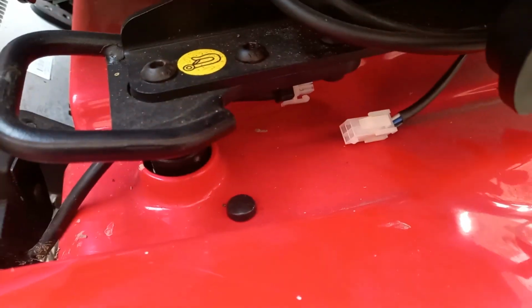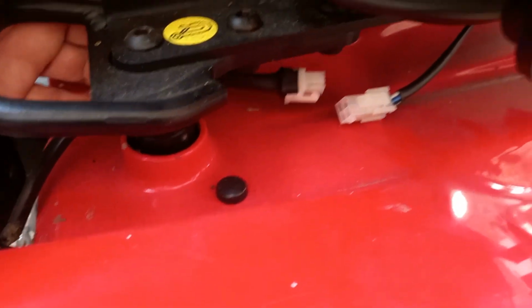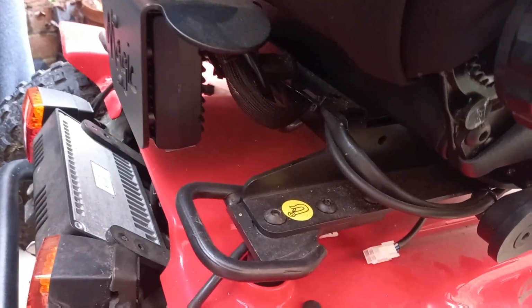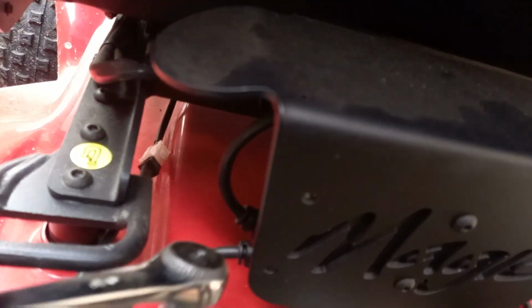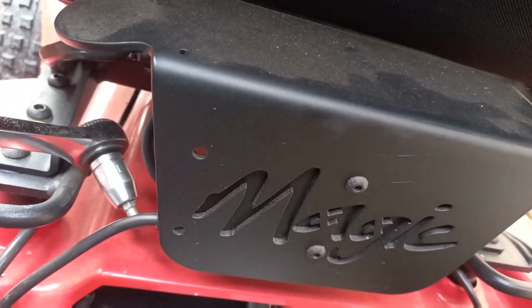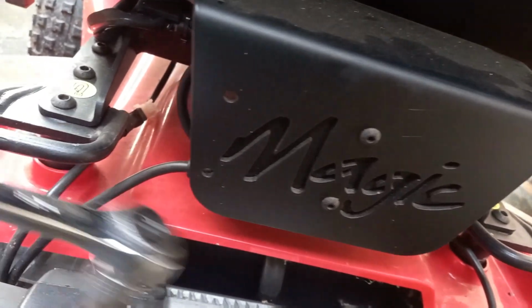Yeah. Right, this has got indicators on, so we've got indicators and lights. Yeah, I've just disconnected that connector. The seat's got to be lifted off, because the batteries are underneath the plastics. You've got to disconnect anything that's connecting the seat to the other parts of the chair underneath. Like, you see what I mean? Like you've got the controller lead there. That's called the CAN bus lead, and that needs pulling out of this unit here, you see, and that goes down to the power module that's mounted there.